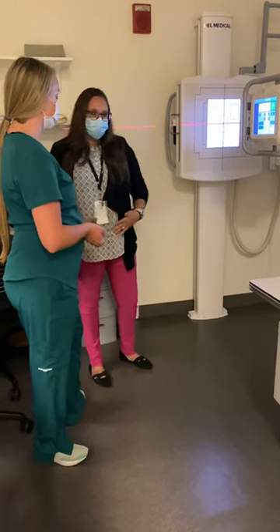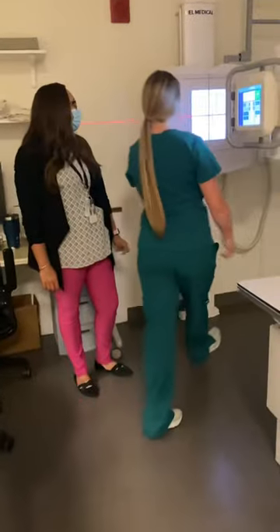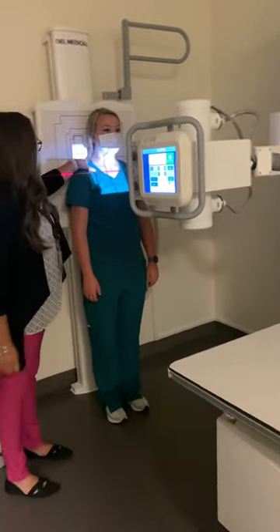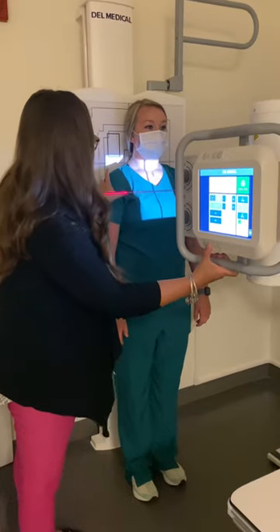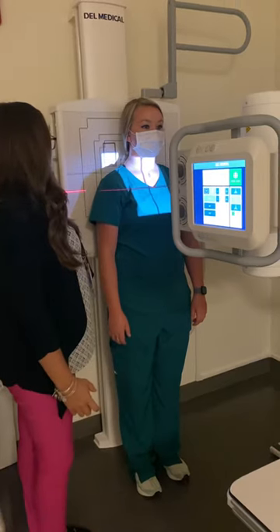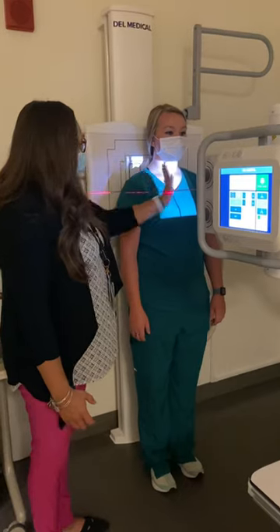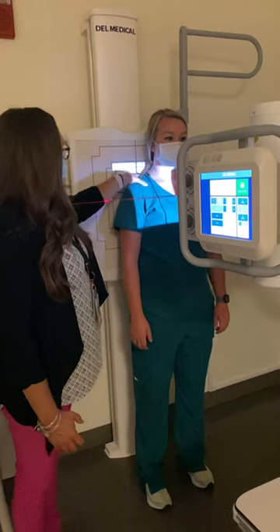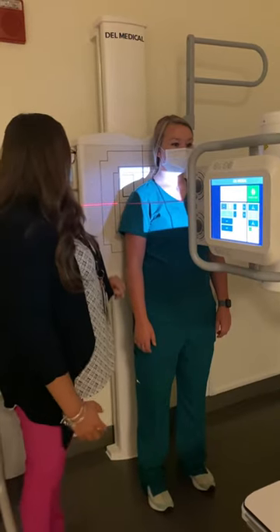The lap shield is going to go in front of my patient for the first view, and I'm going to have her go ahead and put her back up against that board. Your central ray should be 2 inches inferior to the coracoid process, which usually ends up being right about where the armpit would start. You should have at least an inch to 2 inches of light above the shoulder. And I also want to be centered 2 inches medial from the lateral border of the patient, so I'm going to scoot them this way just a little bit.